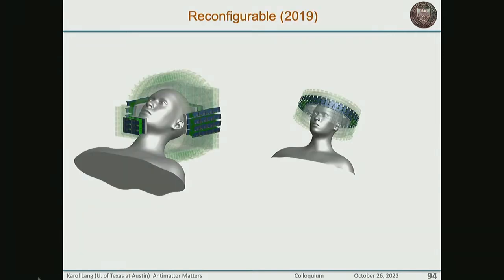So this was our first NIH grant that we proposed, to have a reconfigurable PET scanner, as you see it. So in dark is what you could assemble this way or this way. It was a very limited FOA in terms of budget, and it was not approved.